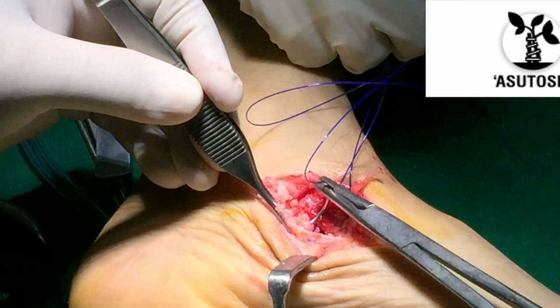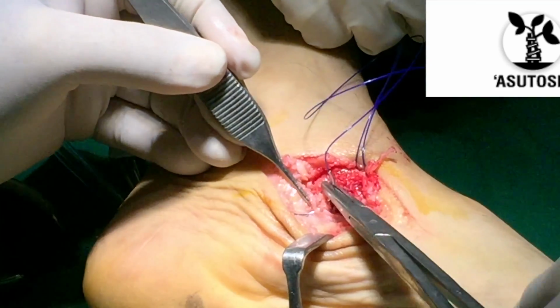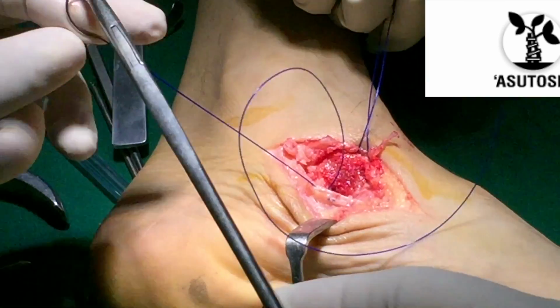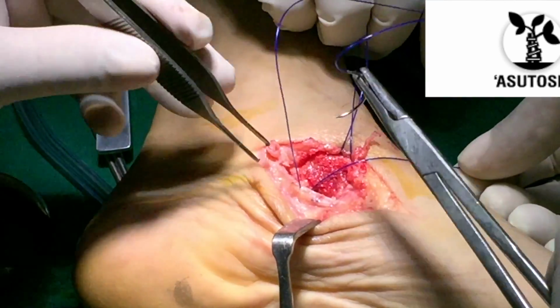We have now decided to tenodese the posterior tibial tendon, basically to shorten it for bringing it into tension.